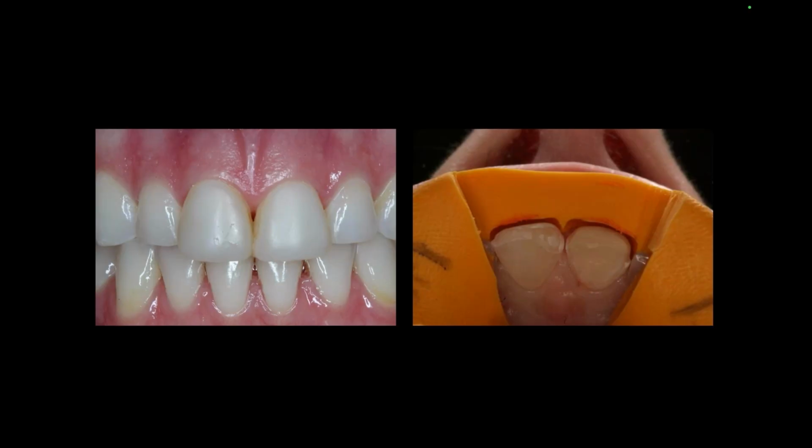Or lithium or zirconia materials, which today are becoming more and more translucent. It's almost funny because I'm sometimes choosing, I have the new VITA ML material, multi-layer, which is super translucent, and I'm experimenting with it and starting to do some cases with it, and it's coming out nice. But I'm going to tell you that there were some cases that I want to layer. That's probably not the best choice for me to use. I probably go back to my ST material, which is translucent, but not super, even though it's named super translucent. It's not as translucent as some of the newer materials.